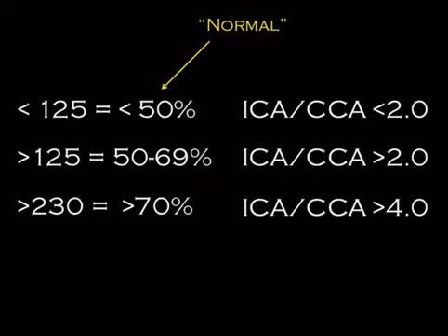Less than 50% is basically all you can tell, and there will be a variety of ways that you could write that fact into a test question to make it sneaky. Now, there is a paper out there that says that you can distinguish between less than 15% stenosis and between 16 and 49% stenosis based on spectral broadening. I think that's a bunch of baloney, because that spectral broadening is so tech dependent, it's really silly to go by that and be able to tell a difference.